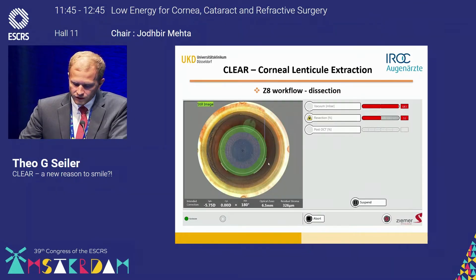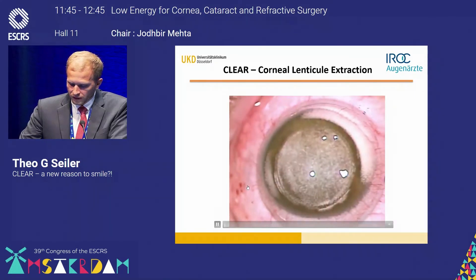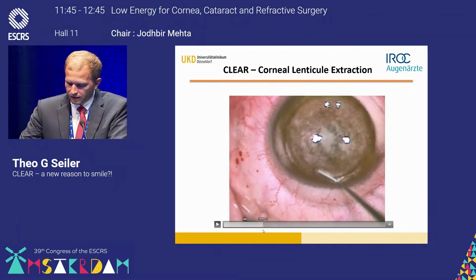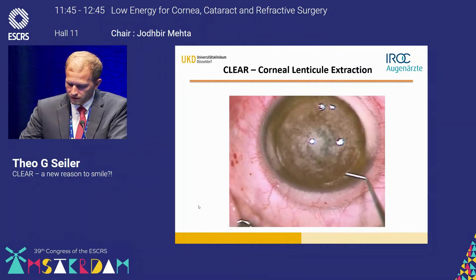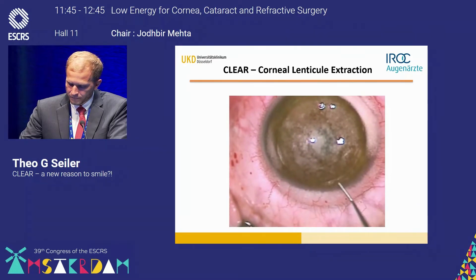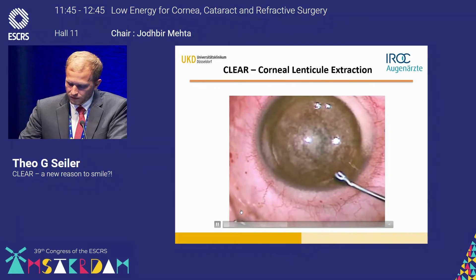For the dissection itself, you start in the posterior plane and then go to the anterior plane. In this video, slightly sped up, I get rid of the cavitation gas so the patient can fixate again, open up the lenticule in the same way, and then prepare the posterior plane, going in with the dissector.